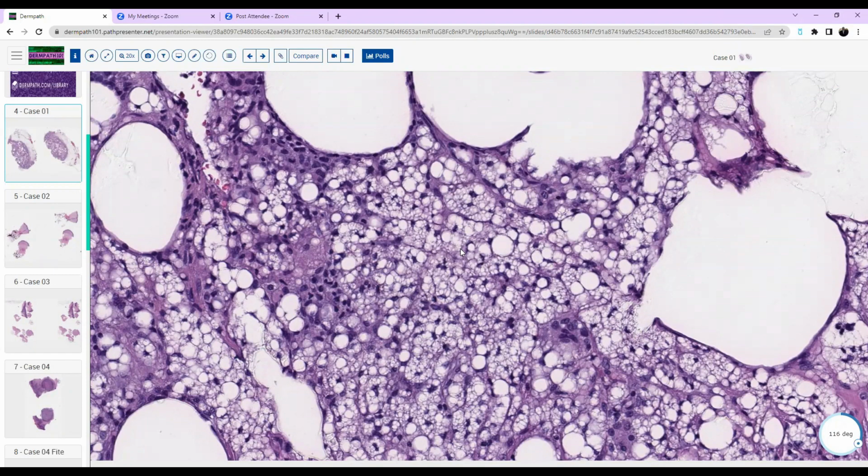Okay, so I guess lipoblasts, or just lipid can do it. Okay, yeah, lipid in general. And so you can see lipid in a regular fat cell. You can see it in a lipoblast, like you said. Where else can you see lipid in fat cells other than those two?